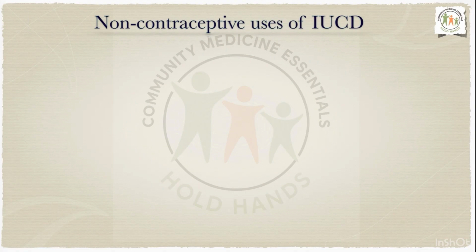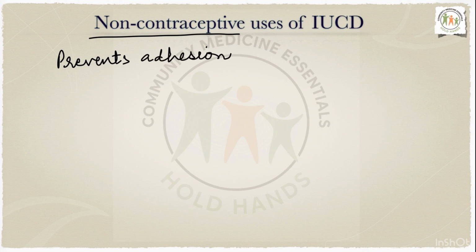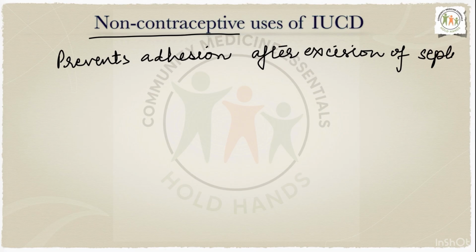Next is, apart from contraception, IUCD has important non-contraceptive benefits also. IUD prevents adhesion after excision of septum of uterus.